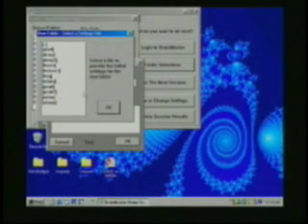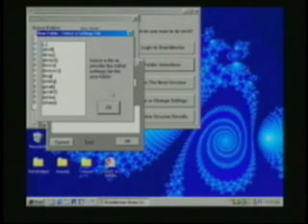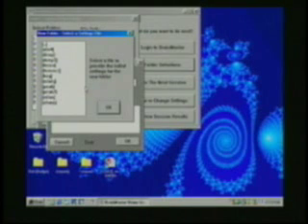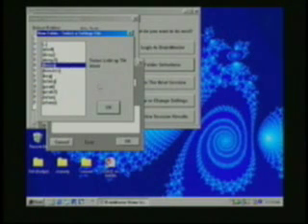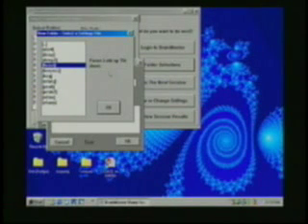We now get a pop-up which lets us select a settings file to provide the initial settings for this new folder. These settings can all be changed before or during the training, but we'll pick a standard one now called Focus. Focus is Low Beta Up and Theta Down, so that's appropriate for this type of folder, and we press OK.